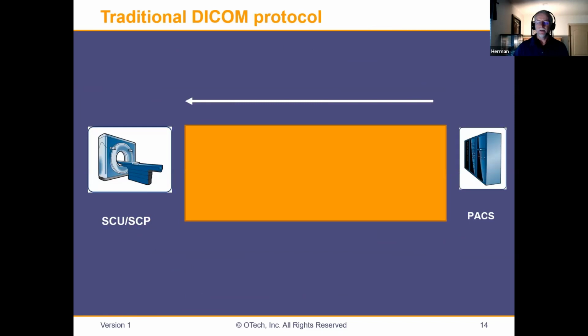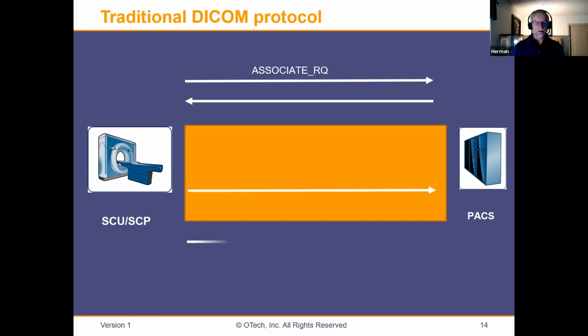So a little bit of a refresher. Traditional DICOM protocol, associate request, right? Associate accept.